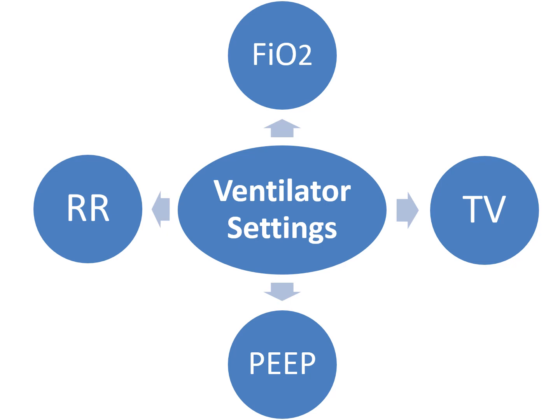So with this, we're going to show you the different ventilator settings. As we progress to the higher level settings, you primarily should know these key settings. The respiratory rate: there is a set respiratory rate, and you should know what that set respiratory rate is so that you can also determine how much the patient is breathing over the vent. The vent will usually be allowed to initiate a breath according to the sensitivity set by the respiratory therapist. The respiratory therapist sets it so that the patient can take certain breaths. It would probably be a setting that you wouldn't realize is there, but it is set so that the patient can breathe in addition to the preset settings.